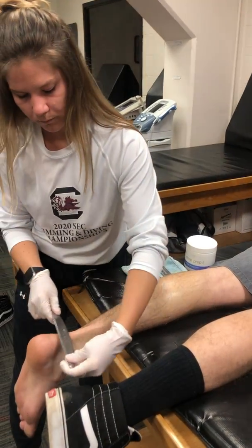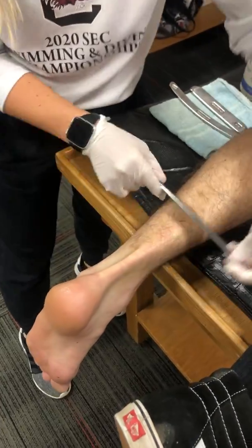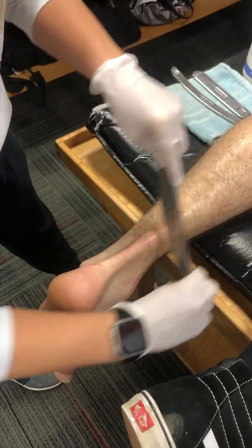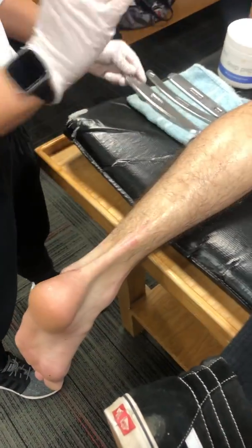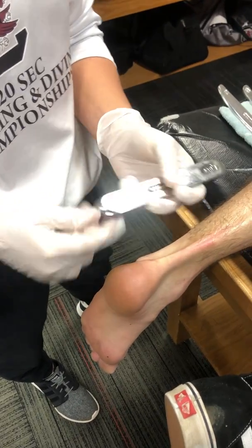Once everything is warmed up, I do more of the actual line work, very lightly starting to work the actual Achilles. Once the area is fully warmed up, I move to the GT3.